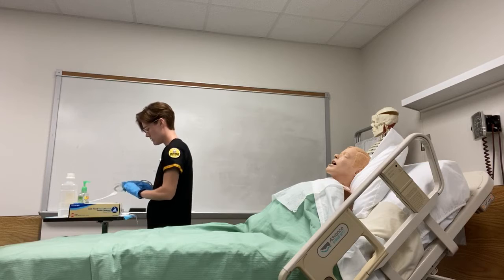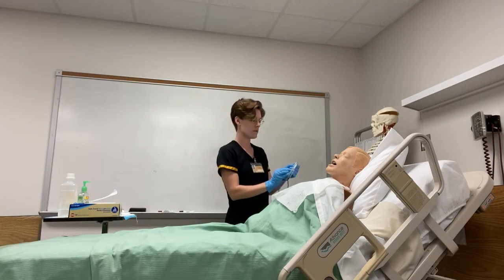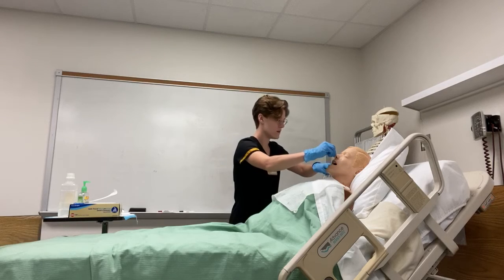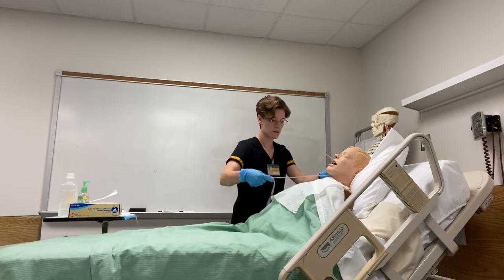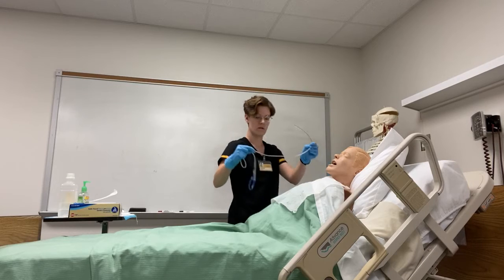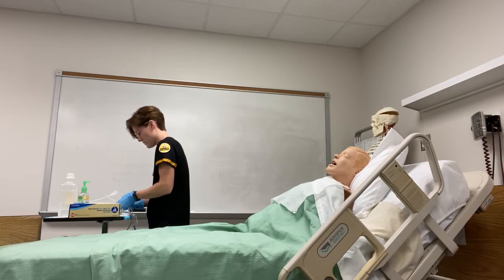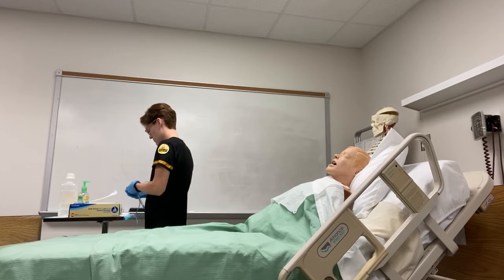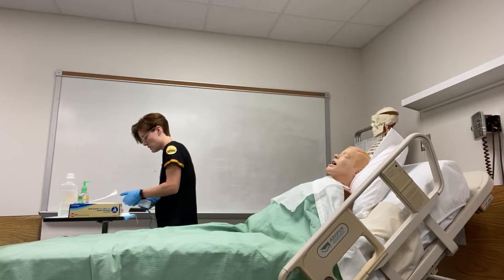Right. And before I lubricate the tube, I'm going to come over here and I'm going to measure from the tip of the nose to the ear, and then from the ear to the xiphoid process. Come back, I'm going to go ahead and mark my tube. Now I'm going to lubricate the tip of the tube about 2 to 4 inches. It's just going to make inserting the tube a lot easier.